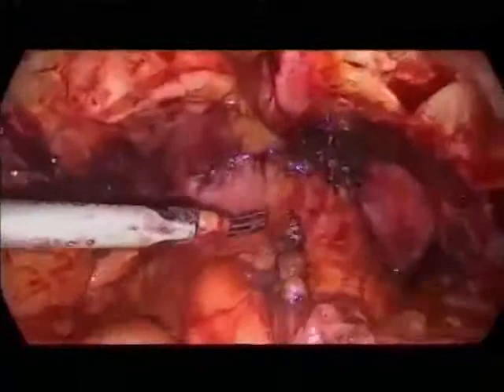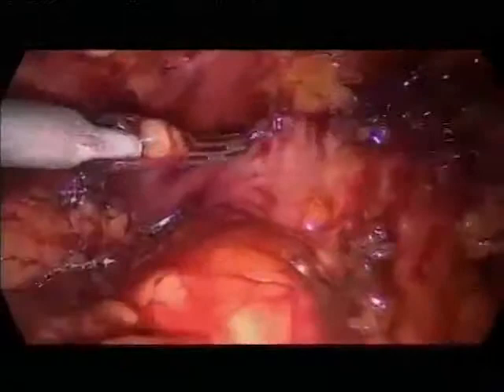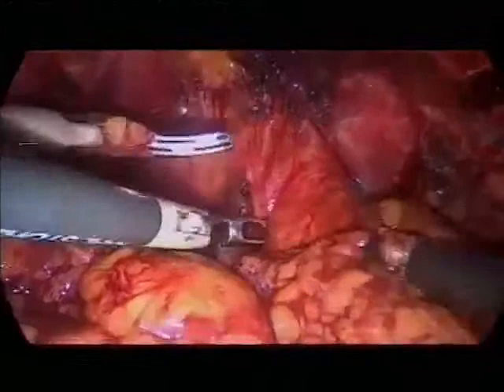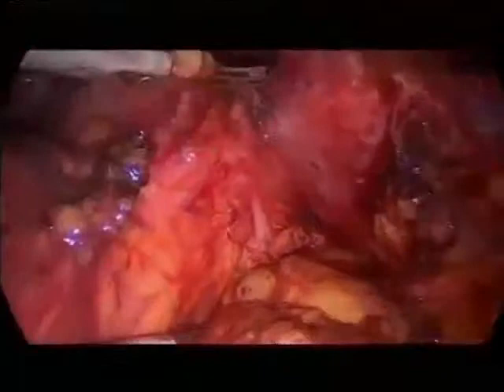This is the prostate here. Here is the prostatic ligament on the right side and here on the left side. And what we will do, we will perform a so-called interfascial nerve sparing. It's different from the conventional wide excision prostatectomy, where we start with the incision of the endopelvic fascia. We don't do this now. We immediately start here on the bladder neck.